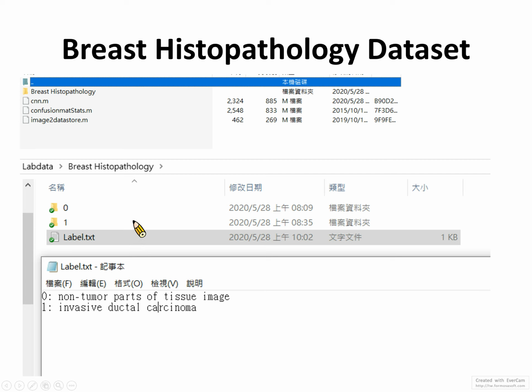There's no universal definition of AI-ready data sets, but the so-called AI-ready data set just tries to structuralize everything you need to train a neural network or machine learning model. We really need structured data to do machine learning.